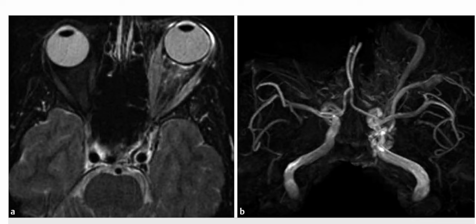So the key imaging finding here is of enlarged cavernous sinus with early venous filling on arterial phase imaging. So the diagnosis here is of carotid cavernous fistula. So this is a case of carotid cavernous fistula.